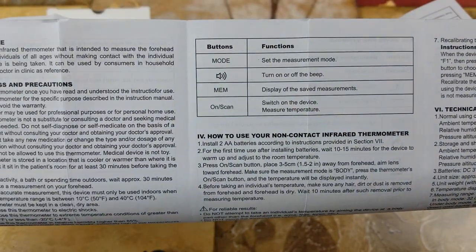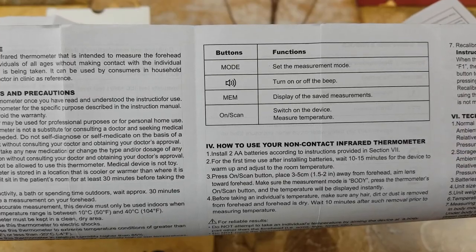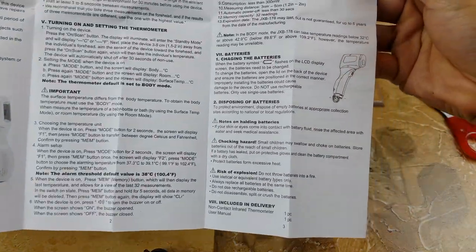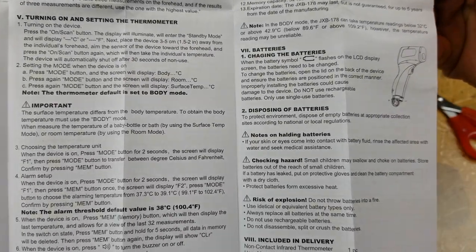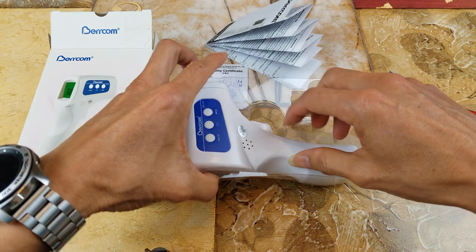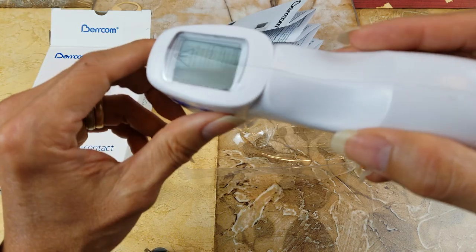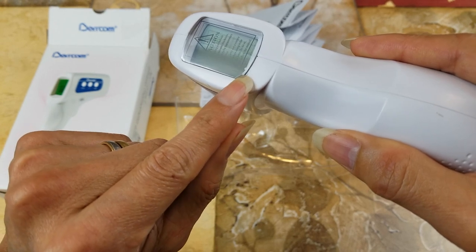It does have a speaker built in — you can turn it on or off for the beep. Let me check the battery compartment and see what size it takes. It might be a double-A battery. Wow, the display is nice — it's protected with a plastic protective cover.